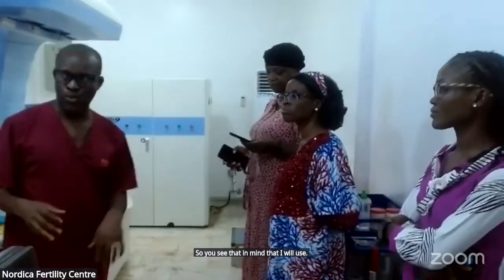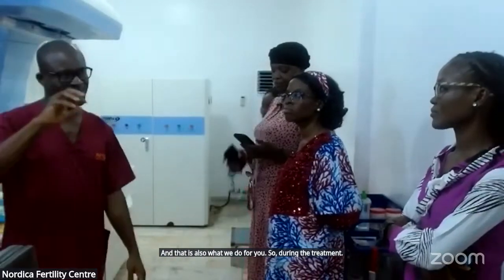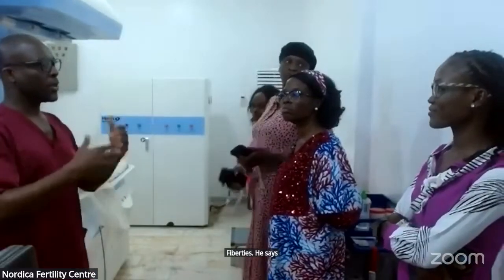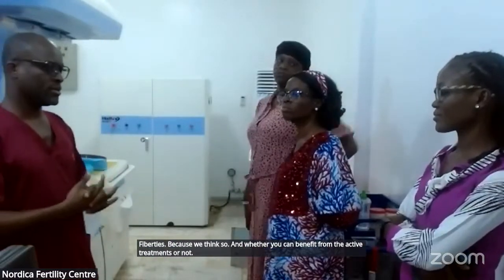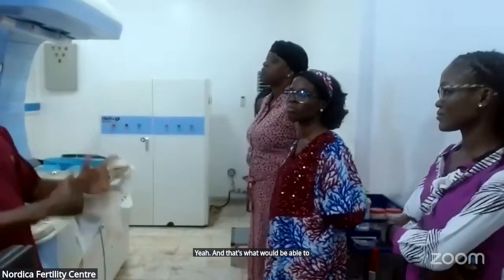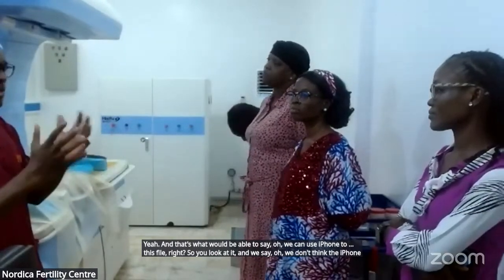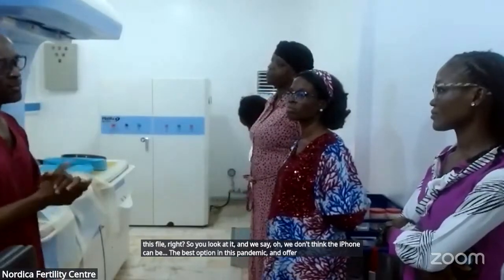And that is also what we do for humans during the treatment, to be able to locate each of those fibroids, and whether you can benefit from the HIFU treatment or not. So that's what we'll be able to say: we can use HIFU to manage these fibroids. If we look at it and we don't think HIFU is the best option in this case, then we can offer you other alternative options.